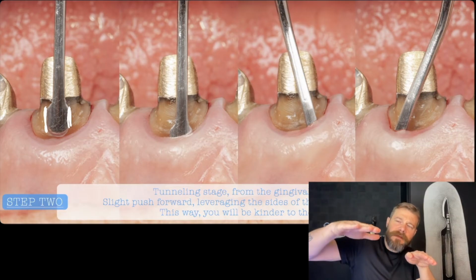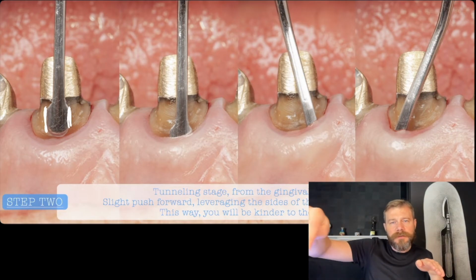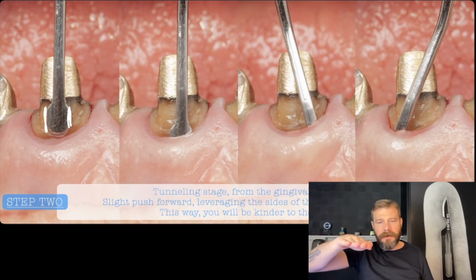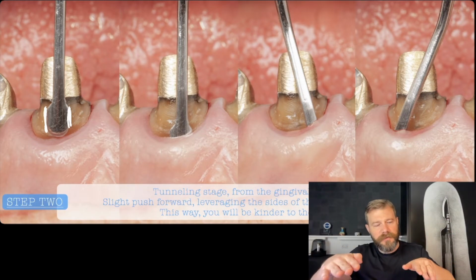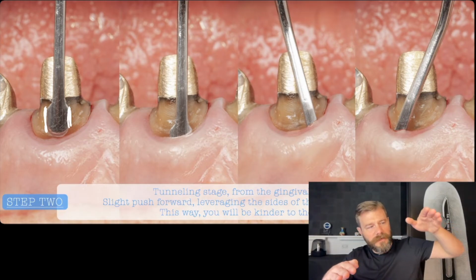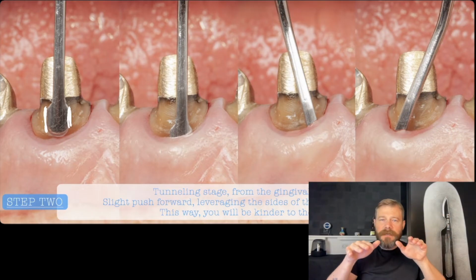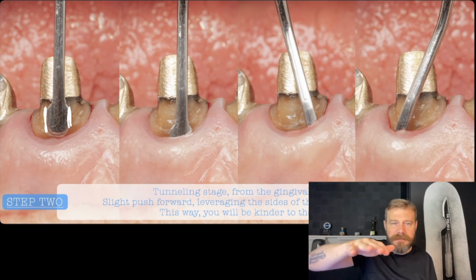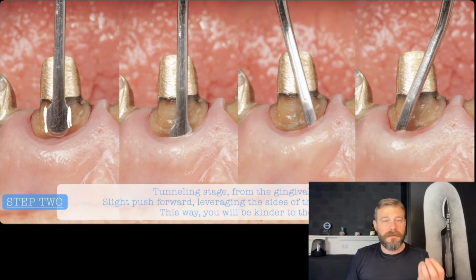The other side lifts a little bit from the ground, lifting the periosteum in a very delicate way on that opposite side. When you move once again in the opposite movement, this part is going to hold on the ground. This other side of the instrument is going to really move the periosteum, and in this way, in a very delicate way, you are pushing slightly forward, moving the instrument sideways in order to detach the most thin phenotype. So when we designed this instrument, we designed it a little bit larger sideways in order to facilitate and make the detachment of the attached keratinized tissue a little bit faster.